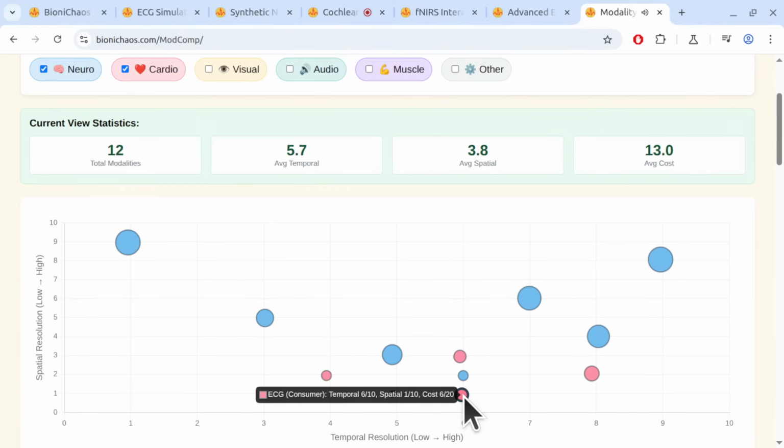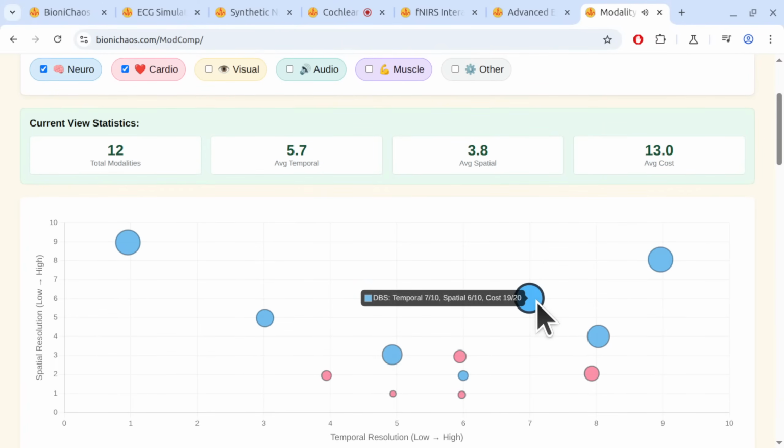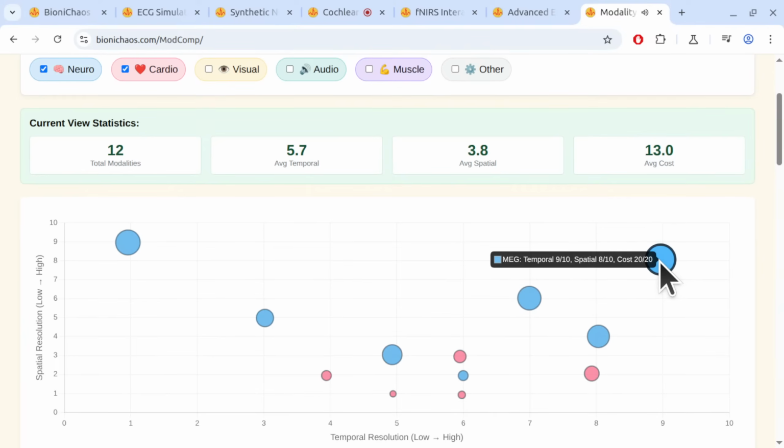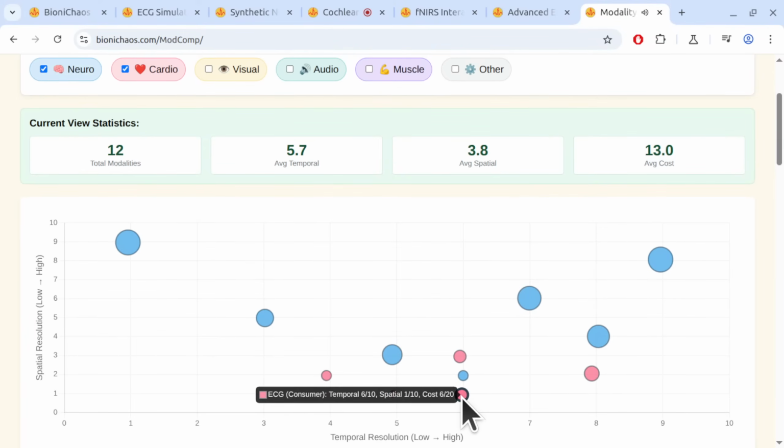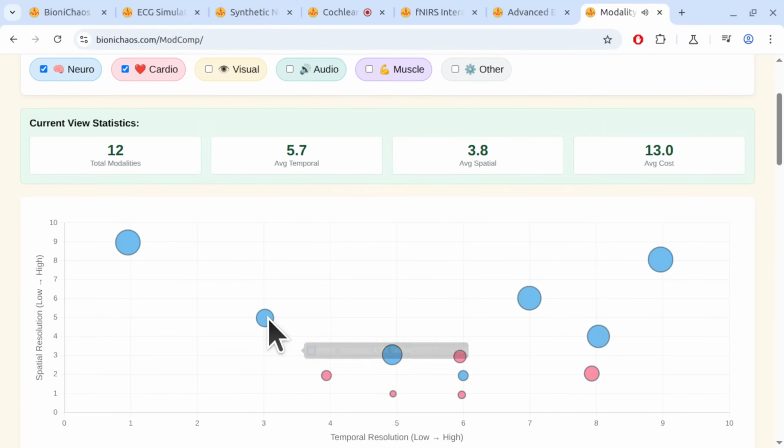Okay. Speed, location, and the elephant in the room. Relative cost. Represented by bubble size, you said? Yeah, bubble size, it's the third dimension here. Bigger bubble, bigger price tag. And this covers the gear itself, setting it up, running it, and the scale goes up to 20 out of 20. Some of these bubbles are, let's just say they represent truly eye-watering sums of money. Getting the best view can cost you a lot. Breathtaking is one word for it.